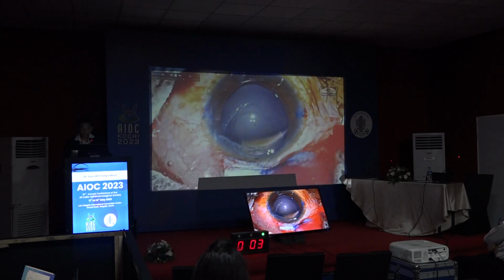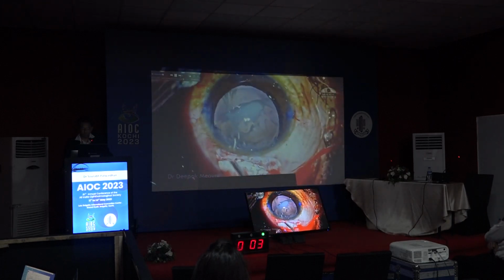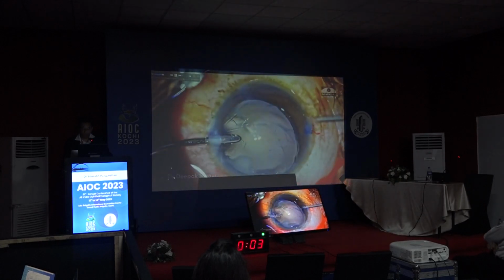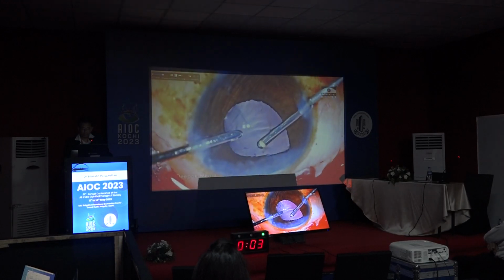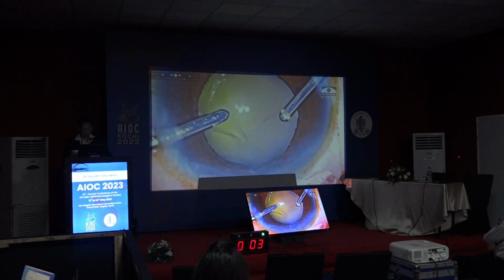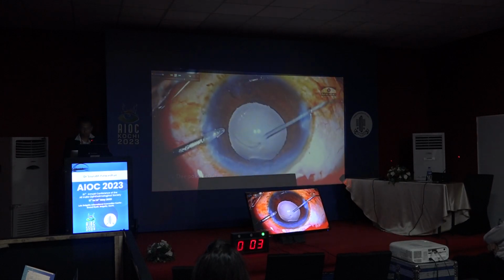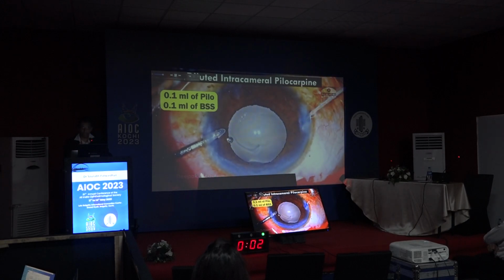Once it is done, you need to ensure that before putting the intraocular lens implant, you take care of all the prolapsed vitreous. The common question which is always asked of me is that, on the outset, the iris claw lens appears to be very easy. Can we do it without a vitrectomy? I think the reason why most of these lenses get a bad name is because we don't do a proper vitrectomy. The most important step is to do the anterior vitrectomy in such cases.